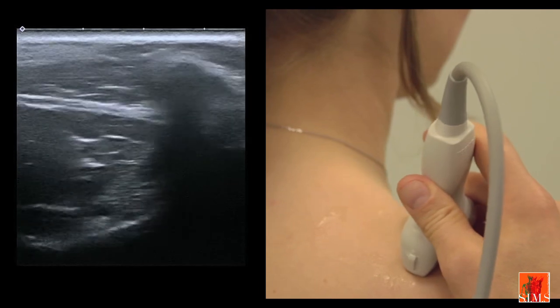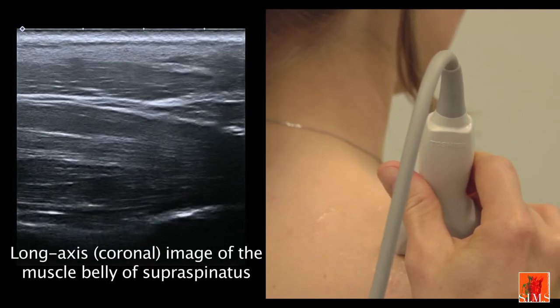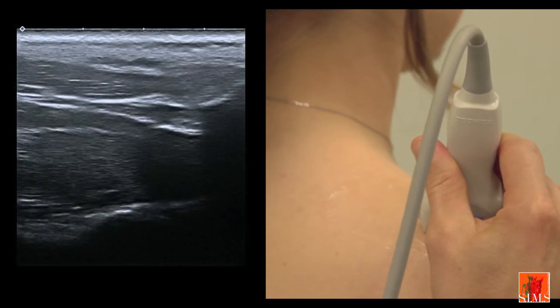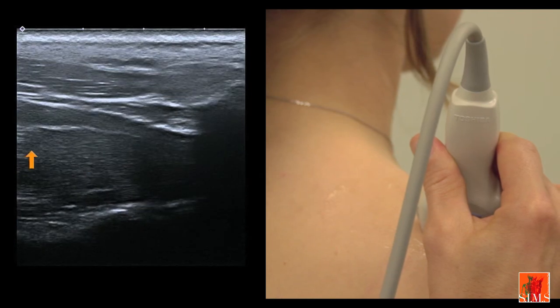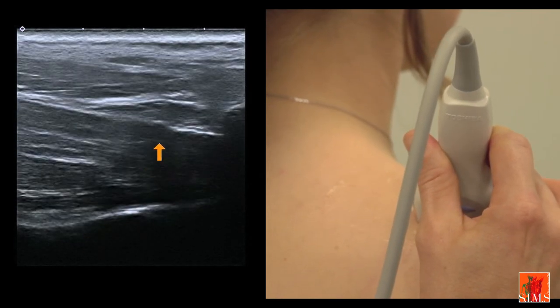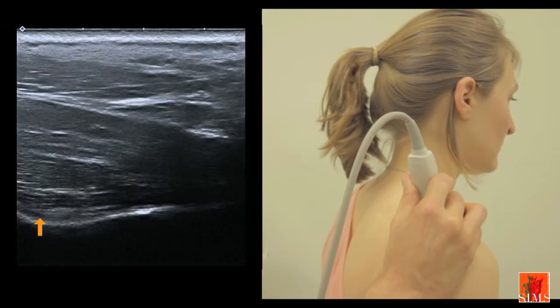In order to obtain a fine coronal image of the supraspinatus muscle within its fossa, we start from the sagittal image. Then we revolve the transducer in an oblique coronal plane. The muscle is thus visualized. We see it running outward here under the acromial arch. On this image, please note here, against the upper border of the scapula, a small vascular structure corresponding to the suprascapular pedicle.